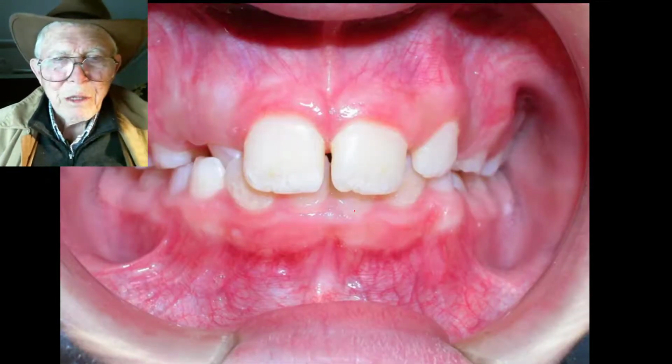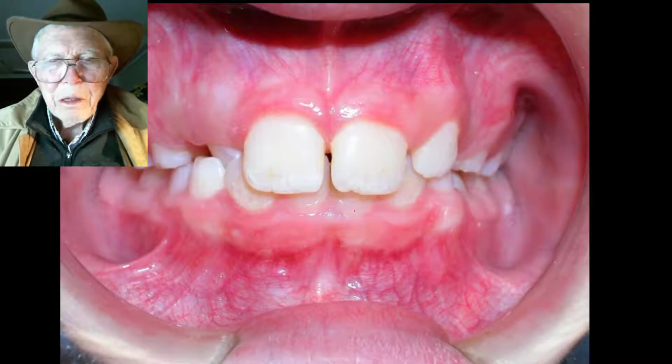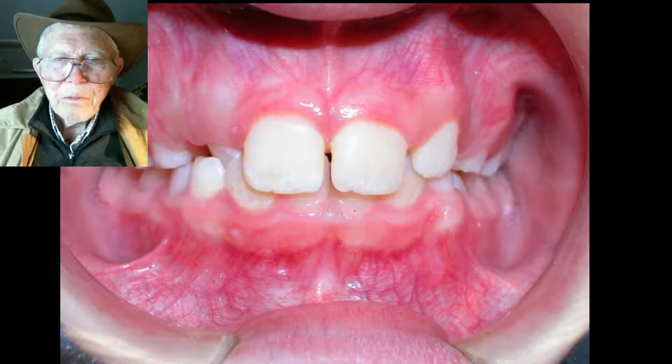He's a neat kid, he's got a good facial structure, facial height, and all these good things are okay, except he's got an extremely crowded anterior portion of the mouth, and the upper portion especially, not the lower portion. I didn't want to take any teeth out on this young man, so we're going to try to save everything we can. You look at the models, he's not a mouth breather to any extent anyway.